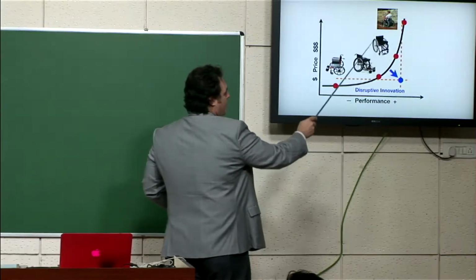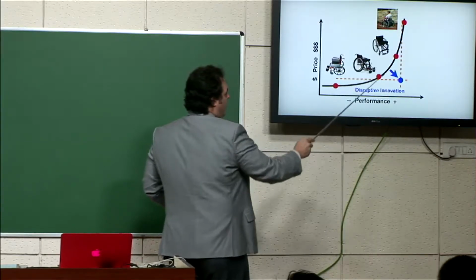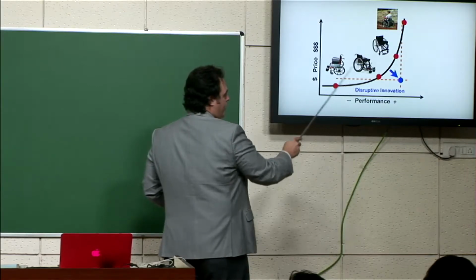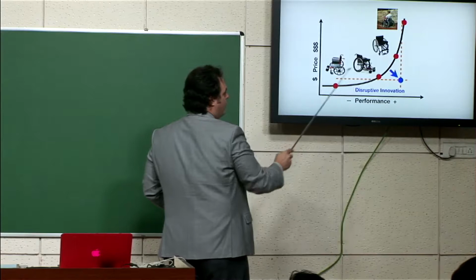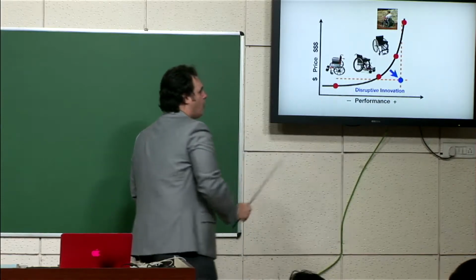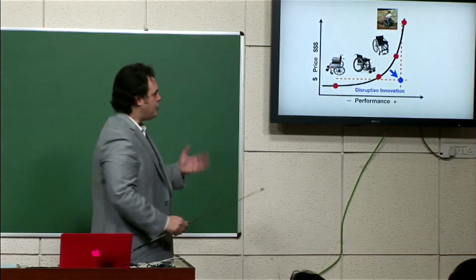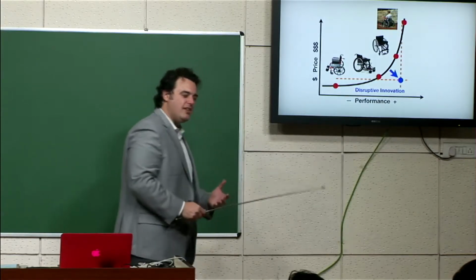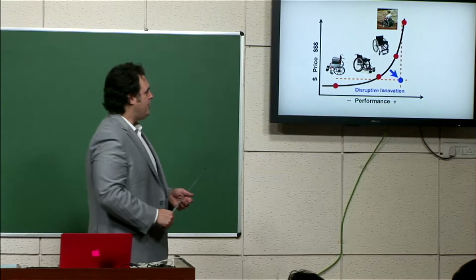This is maybe around a few $1,000s. Here is an appropriate developing world wheelchair that's pretty rugged. It's around $300. And then this would be a lower quality, mass manufactured, Chinese wheelchair. It has injection molded wheels, and it's maybe not designed for the rugged conditions in a developing country.